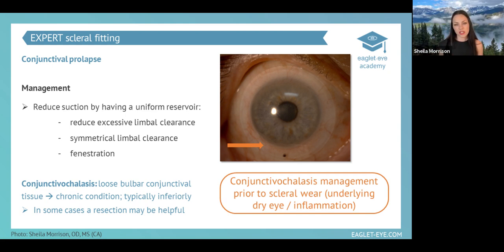Now, in some patients that suffer from prolapse, and again, that area is at a higher risk for blood vessel growth and not enough oxygen, and then of course, discomfort and redness, we sometimes need to manage other conditions besides just the contact lens fit on its own.